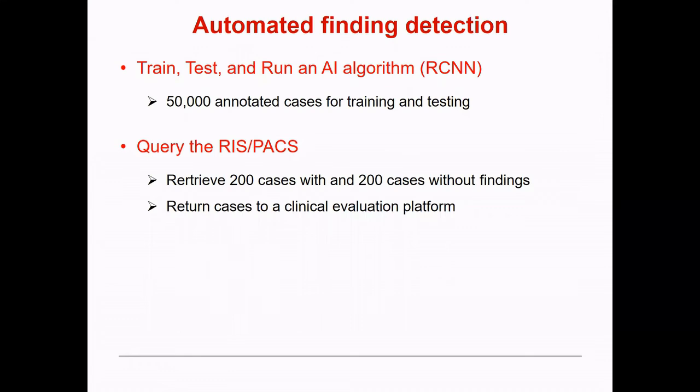Just to show a little bit about automated detection, we didn't do that for the lung tumors, but we did that for something that is a bit more challenging: acute abdominal pain. These are people who come to the emergency room and may have appendicitis or not. For me, the next step is, instead of the doctor painting all these lesions or findings, we might have algorithms that already find them and the doctor corrects them.